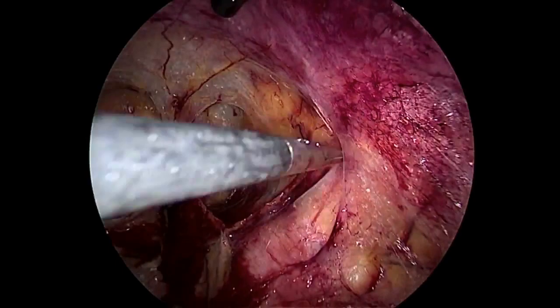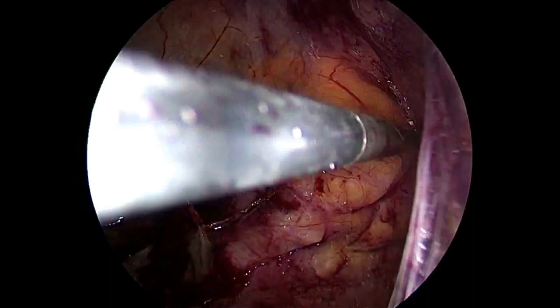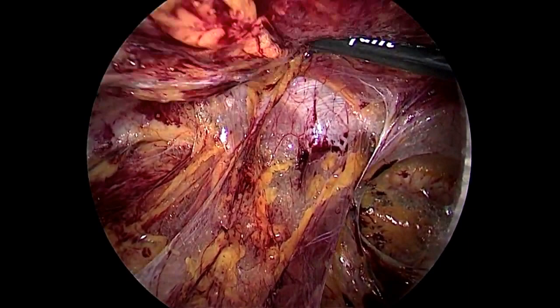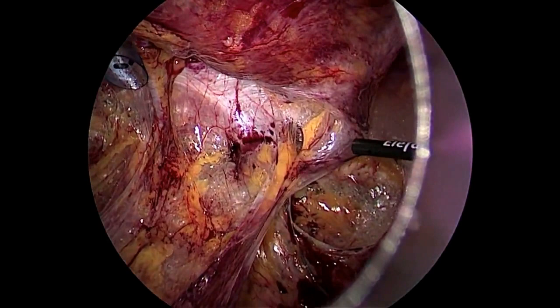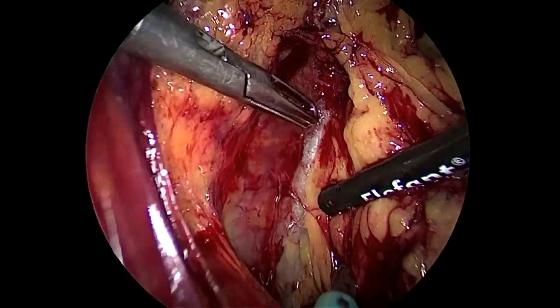I now need to dissect the space here in order to put the trocar for the second surgeon. And so this could be here. Trocar, please. Okay. On the left side, thanks to the balloon, it has been possible to have a perfect dissection. And so I introduce now the trocar again. Okay, the trocars are well placed in a good disposition. So can you give me this one, the step? Thank you. Another, please. Okay, I clean, as you can see, the pelvic fascia, and I try to remove it.